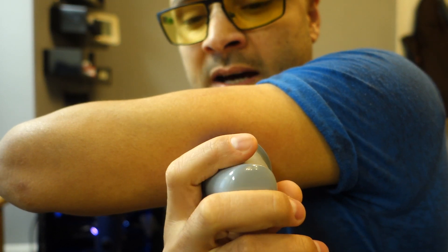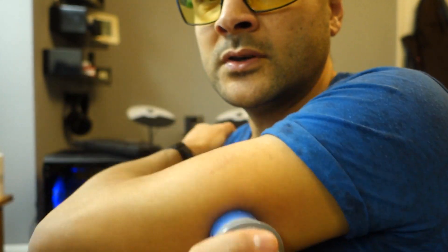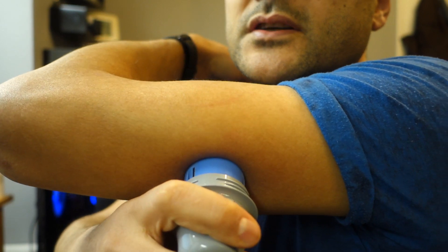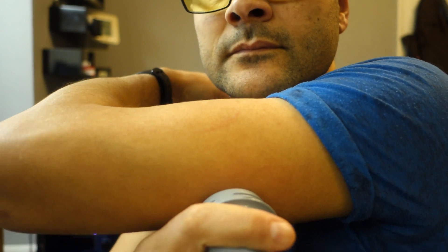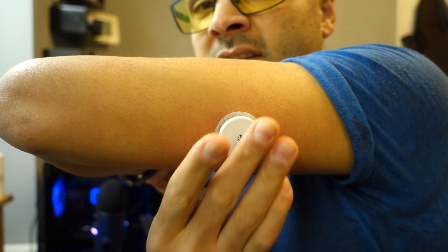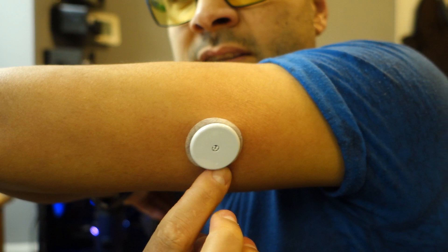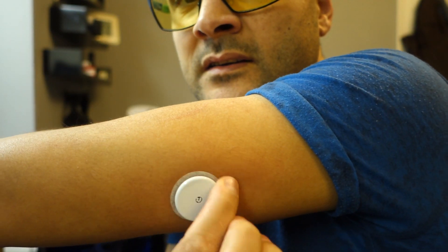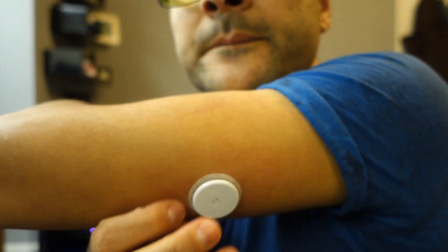Put it against your arm, vertically against your arm. One, two, three — push. Didn't feel anything. When I pushed, I made sure it was well pressed against my skin on every angle. You can see the tape is already in — just make sure it's all on every edge, and that's it. Voilà.